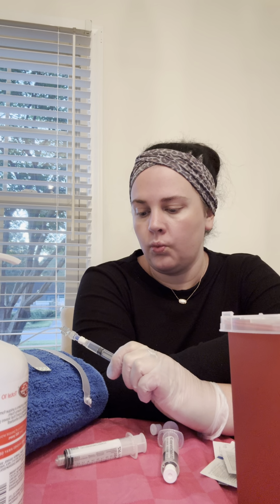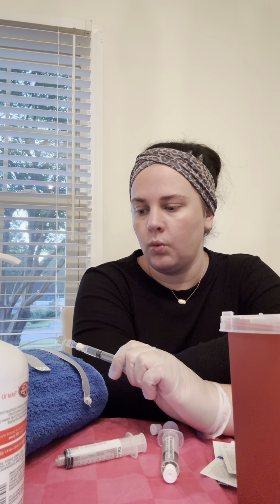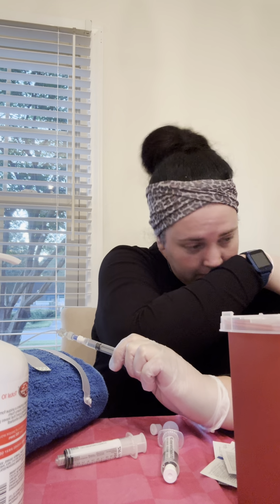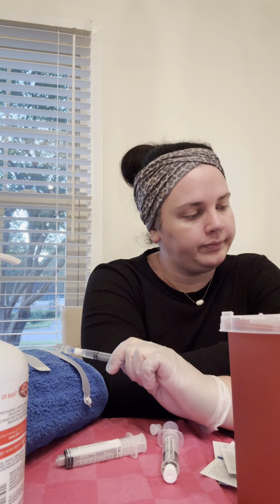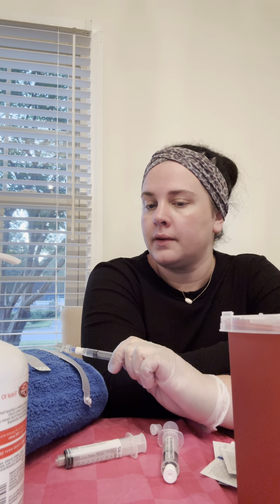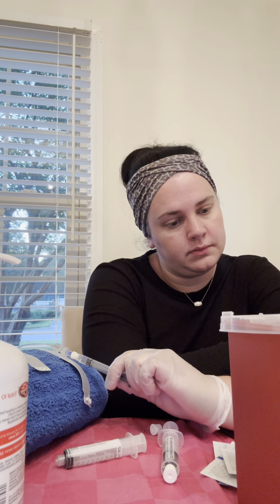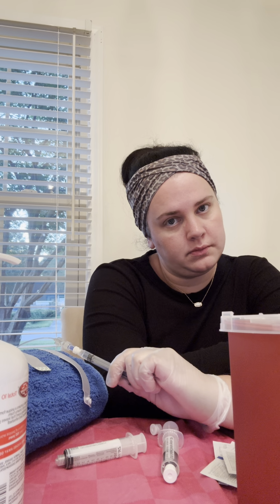And we are at the halfway mark here. So just 1 more ml to go, Miss Adams. Just a little bit longer.